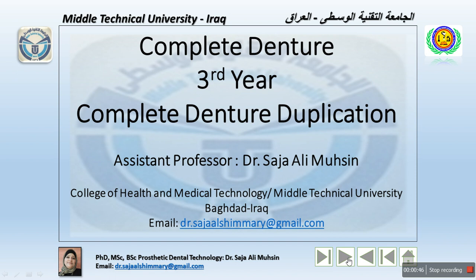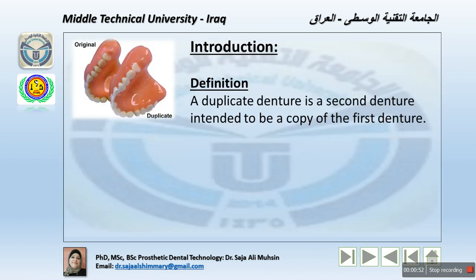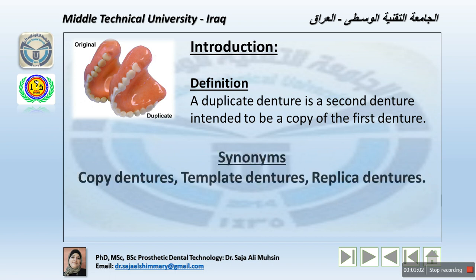Today, we will discuss the aims and the processing of duplicating a complete denture. A duplicate denture is considered a second denture intended to be a copy of the first denture. There are many terms and synonyms giving the same definition of duplicate denture, like copy denture, template denture, replica denture.